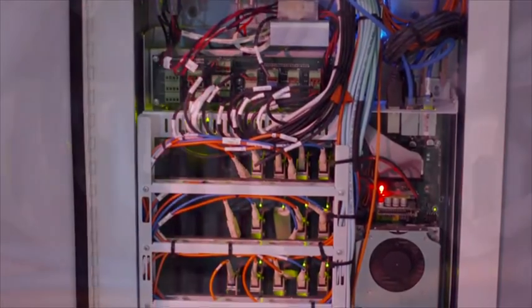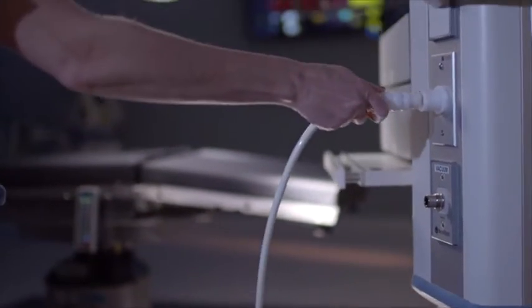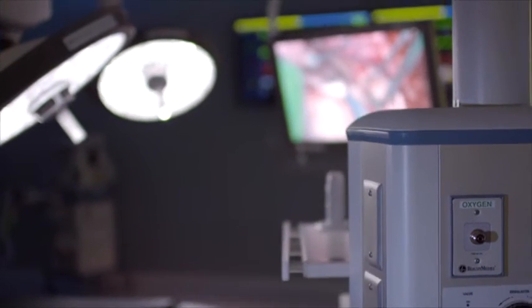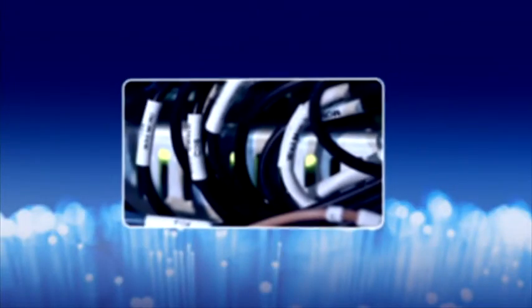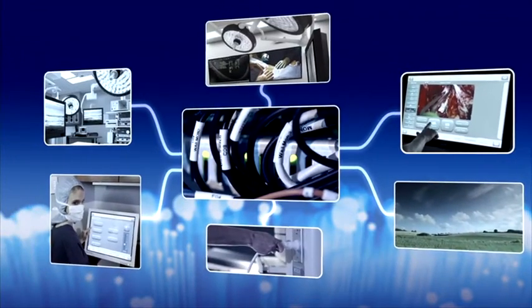It maintains a small footprint and is anchored by a fiber optic backbone. Universal ports mean plugs are easy to connect. They're durable with no pins that can bend or spread after repeated insertions. Further, they're scalable to higher bandwidths so the system can grow with your needs.